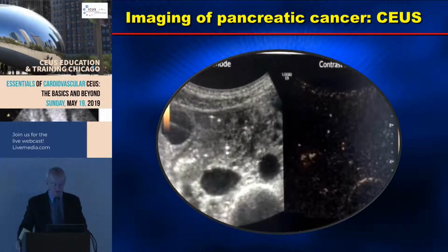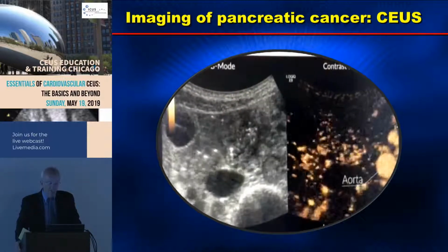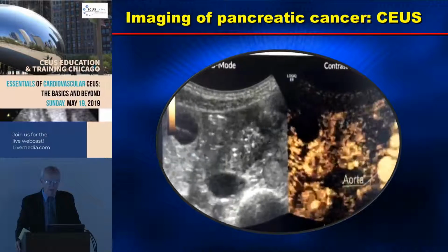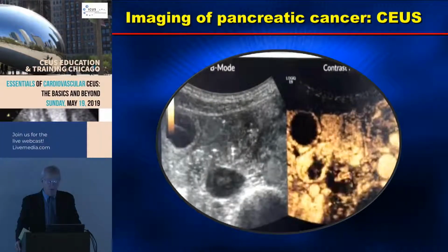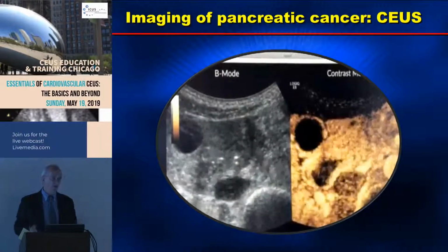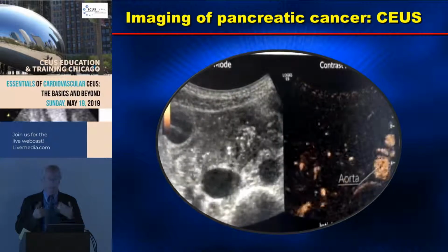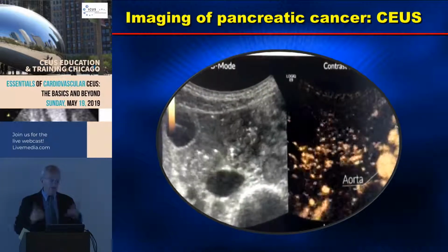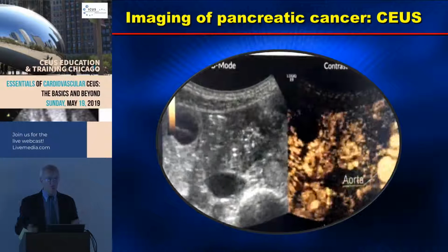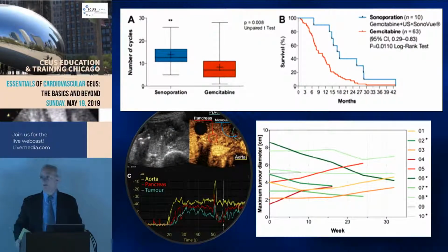This is what it looks like. So this is that patient's abdomen, and you can see the pancreas right in the center there is very bright white. So when people say, oh, the pancreas has not much blood flow, when there's tumor in there, it has a lot of blood flow. That helps us because the bubbles go to every capillary. You turn the ultrasound on, you open the pores, you get your chemo in. Okay. So what's the end result here?